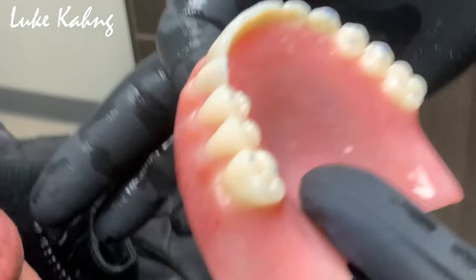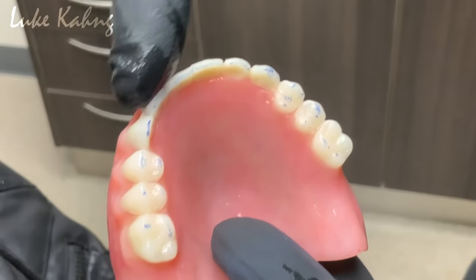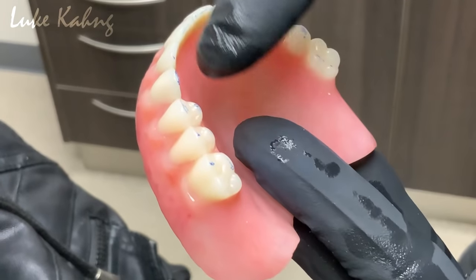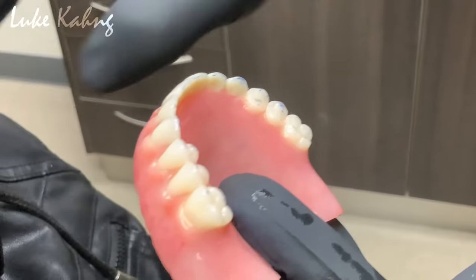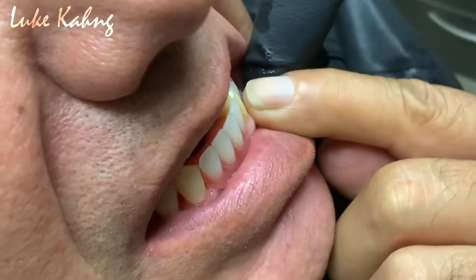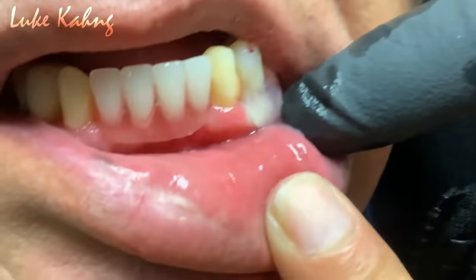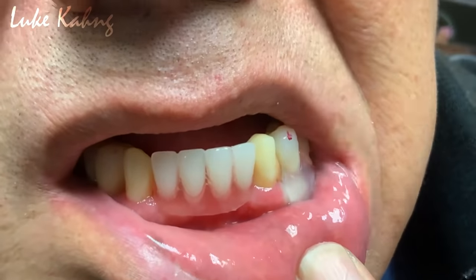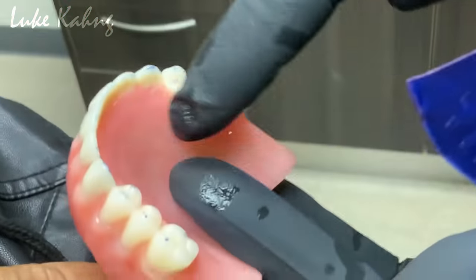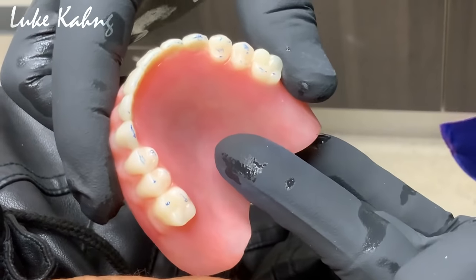And then we want him to be in contact on every posterior tooth. Look at that. He's in contact on actually every single tooth. Okay, so right now, pretty much even. Very nice. On the bottom, he feels that when he bites down, he's putting too much pressure on his clasp. Here, turn over here, this way. So sometimes when it's too high, I'll check the top first, and this is pretty consistent, pretty even, very nice. Almost every tooth has a mark.